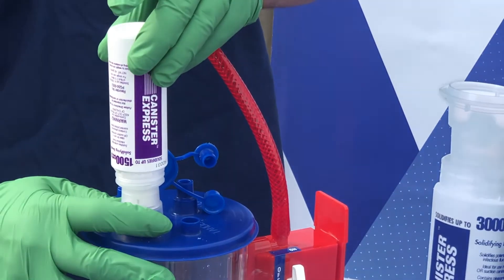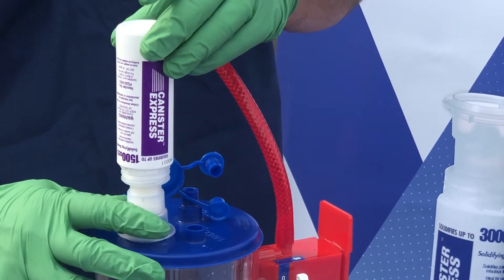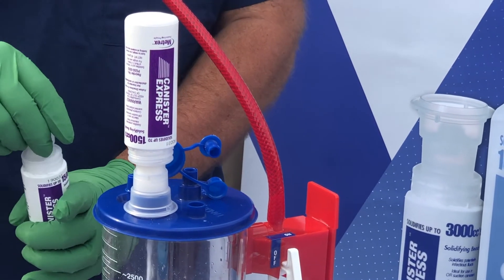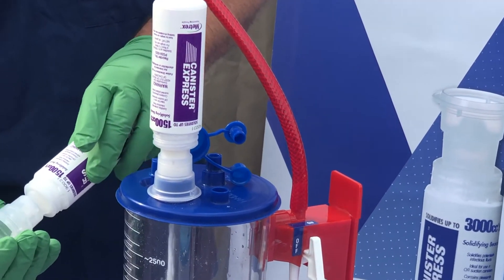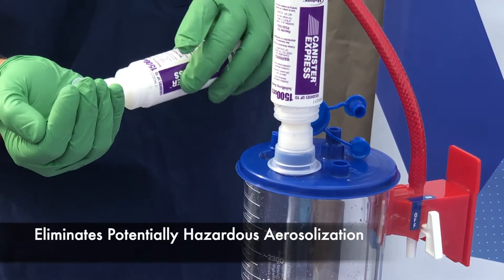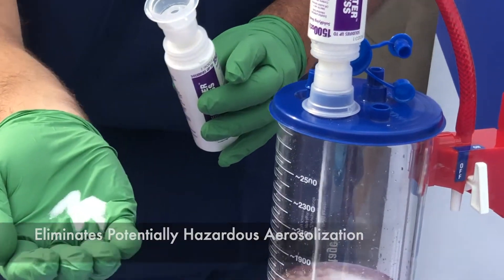After the procedure, there is no need to ever open up the filled canister. Pull up on Canister Express to begin the release of the solidifying agents. This closed delivery system eliminates potentially hazardous aerosolization of the liquid waste.